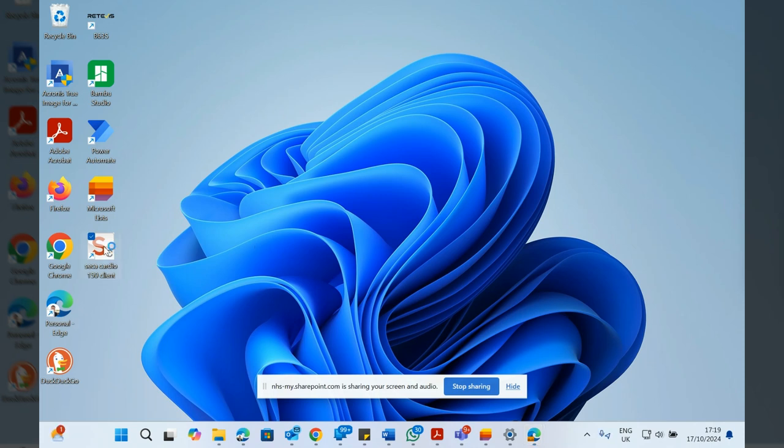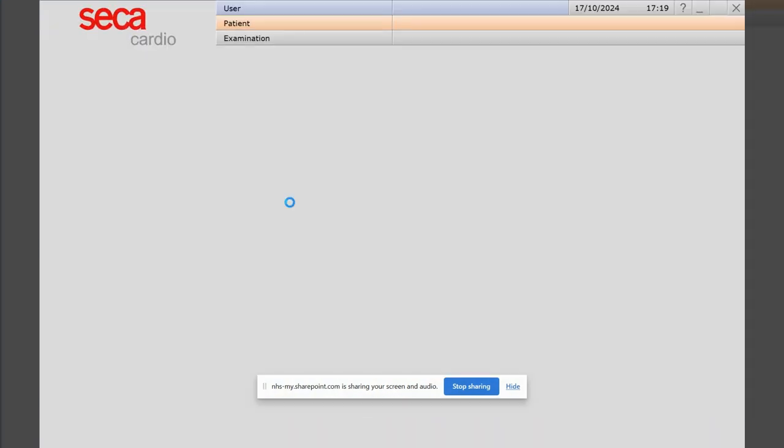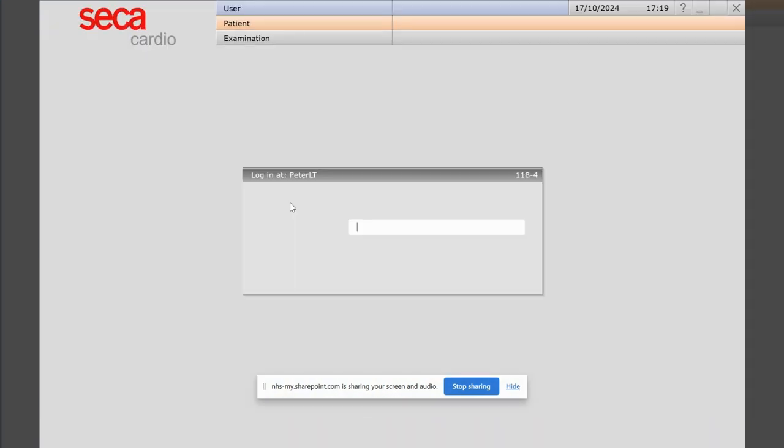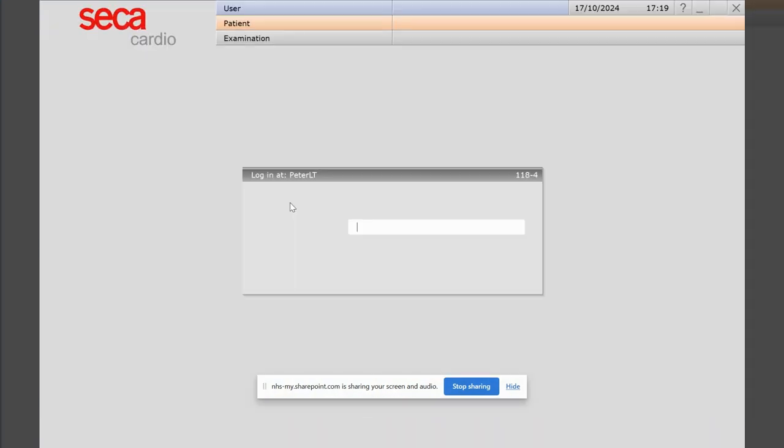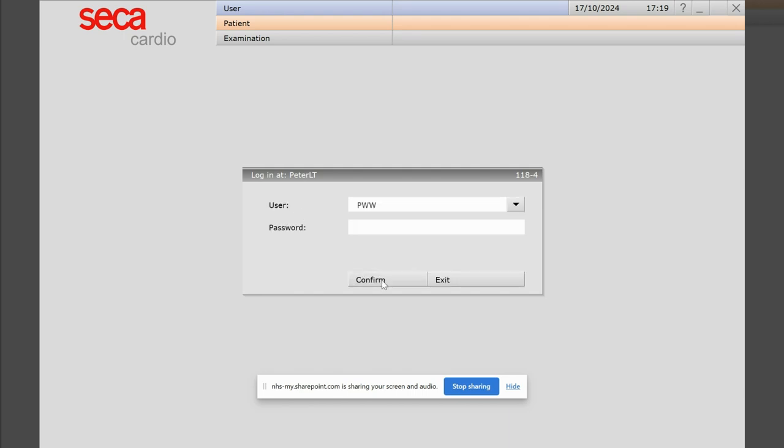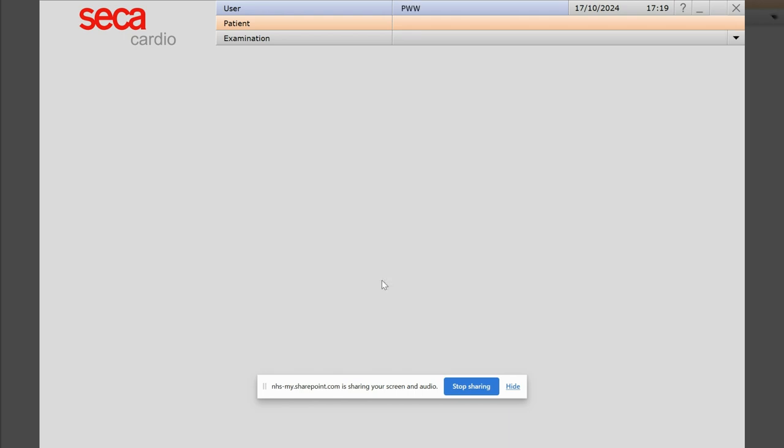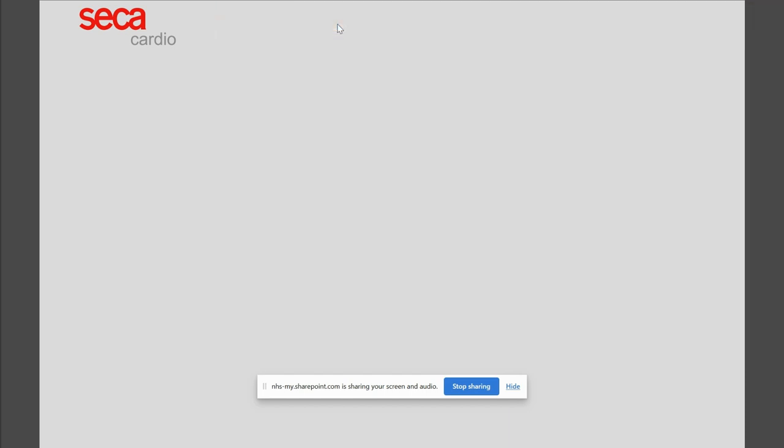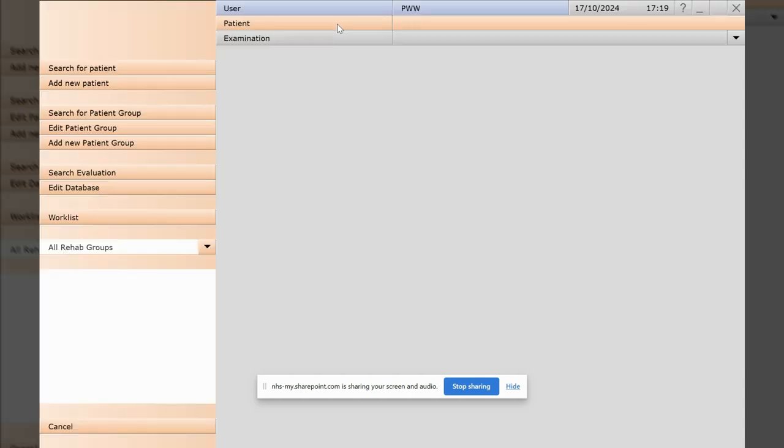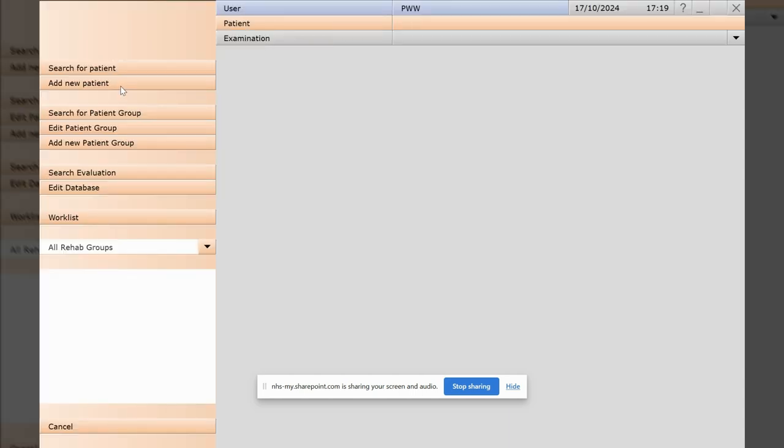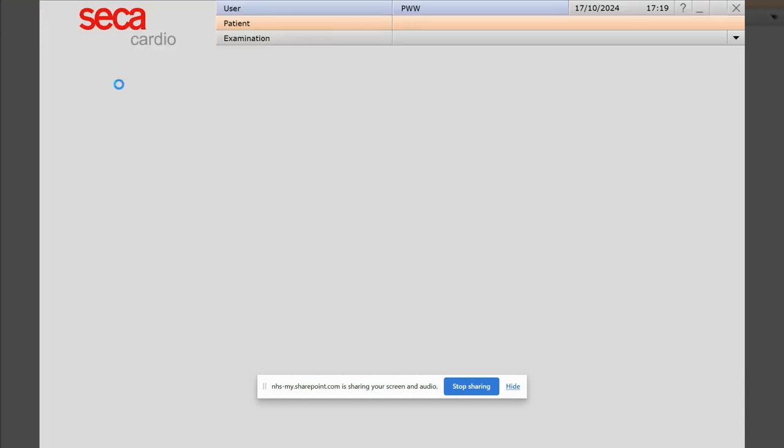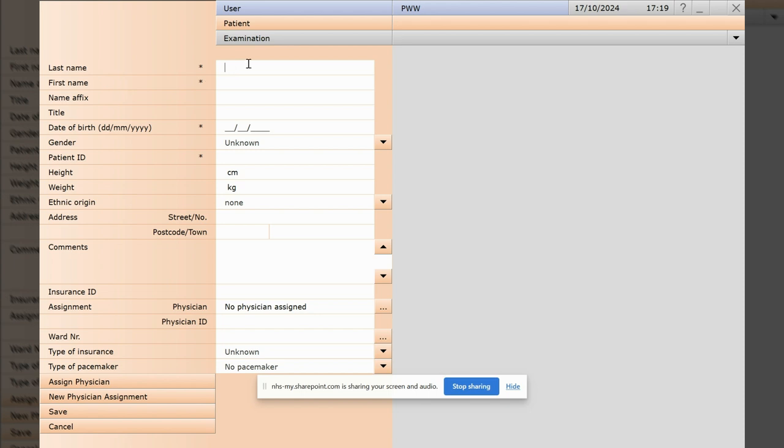You will not have a password set, so just hit confirm. The first thing we do is we need to enter the patient's information, so just click on patient and add new patient, and then type in the name of the patient.